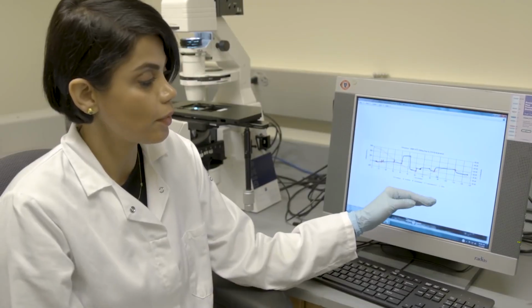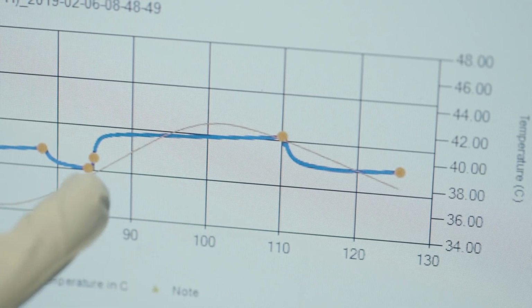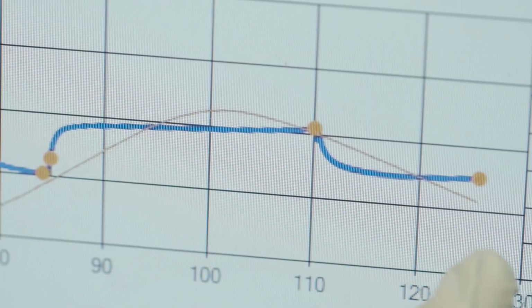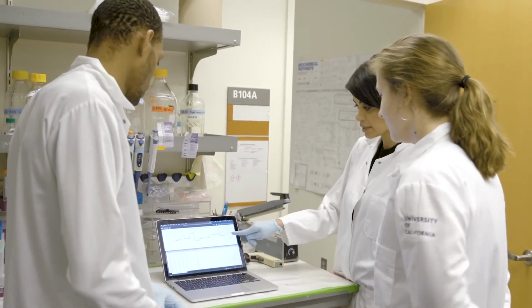This shows you the response that we get from CRISPR-Chip. Here, you're looking at when we actually introduce our DNA sample and remove it from the sensor. This endpoint, if it doesn't match this initial point, means that our CRISPR-Chip was able to detect the gene that we programmed it to detect. Which sample is this? This is a DMD sample.